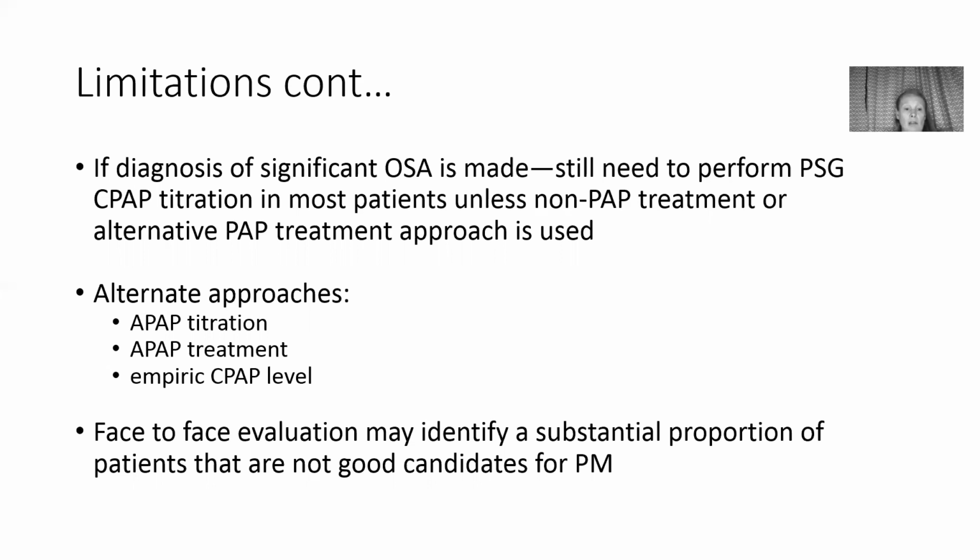Unfortunately, some people are also doing auto-PAP treatment, meaning they set up the device to perform auto-PAP, and then they just leave the patient on the auto-PAP. They don't even set up a CPAP setting for continuous use. They just leave them on the auto-PAP device.